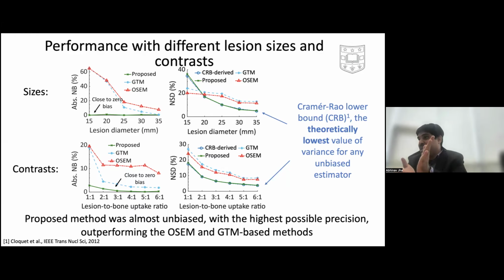So for example, let's say I'm trying to estimate activity in the liver. Liver may not have constant uptake. There will be regions which have high and lower uptake depending on the lobes that you are in. With this methodology, if you are able to first do a reconstruction and look at that heterogeneity, then you can define VOIs, and if those VOIs within the liver are homogeneous, you will get accurate activity uptakes within those regions. So I think of this as something that complements reconstruction-based methods, where this is set up for the task of quantification, provided you can satisfy the model assumption of VOI uptake being almost constant.